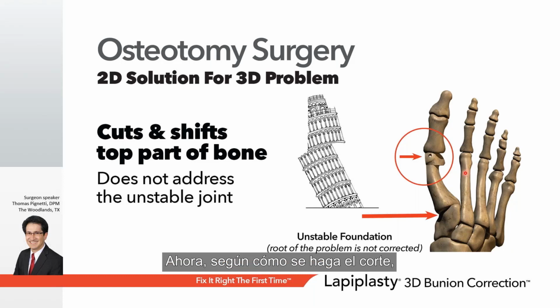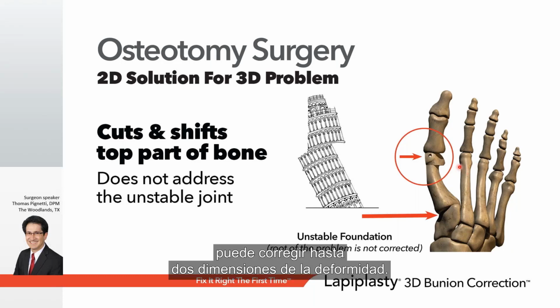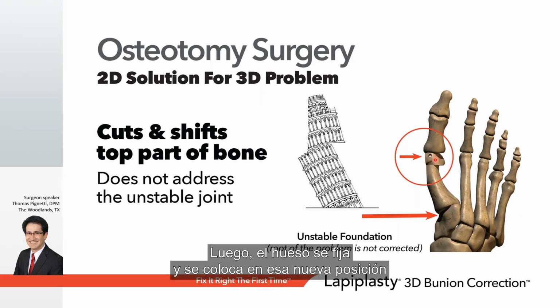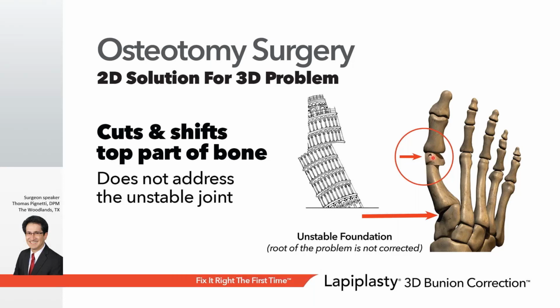Now, depending how the cut's made, it can correct up to 2 dimensions of deformity, typically the sideways and maybe the elevating dimensions of the deformity. The bone is then secured in place in that new position with a screw or some other type of device.